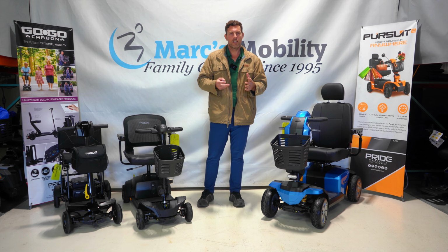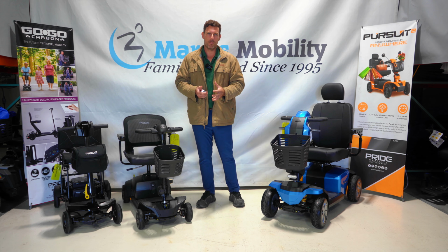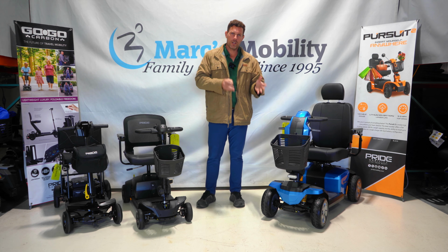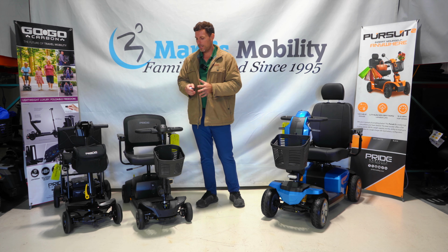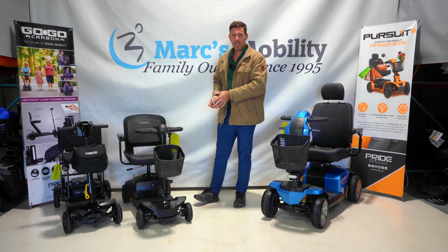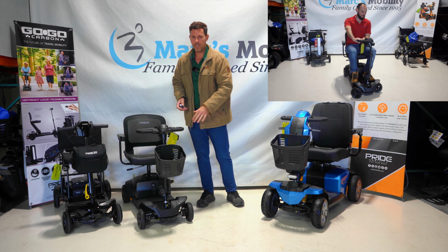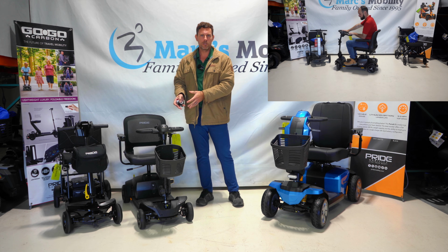Now, while there are three and four-wheel scooters, a four-wheel scooter is typically going to be a little bit more stable than a three-wheel scooter just because you're going to have four wheels on the ground at all times. Four-wheel scooters are typically going to have a larger turning radius than a three-wheel scooter, but there are some new products on the market, such as the Elite Traveler 2 Platinum here by Pride Mobility, which has easy turn technology, which is going to get you the turning radius of a three-wheel scooter and still have the stability of a four-wheel scooter.